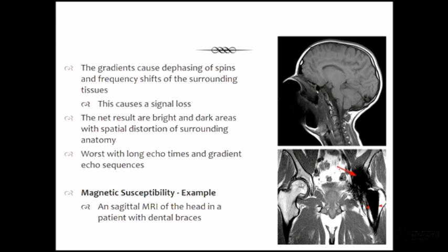So here's our femoral head. Here we're seeing our greater and lesser trochanters and femoral neck, and on the other side is our iliac wing, and we've got a hip prosthesis. So we can still scan these sorts of patients. It's just that if this is the area of interest, if we're trying to look at something related to that hip joint on that side, we're not going to see it because we're going to have too much artefact.